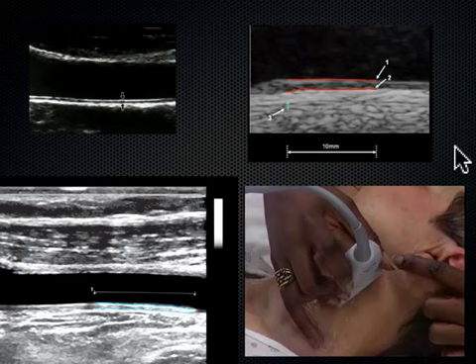CIMT. Any questions before we change gears one final time? Just something to introduce you to. And when we look today on the models, it's just a linear echo. You can't even see a separation because everybody's so young and healthy, okay? But when you take this machine out to preceptorships or who knows where, clinics, wards on older patients, you will start to see these thicknesses come off the screen.